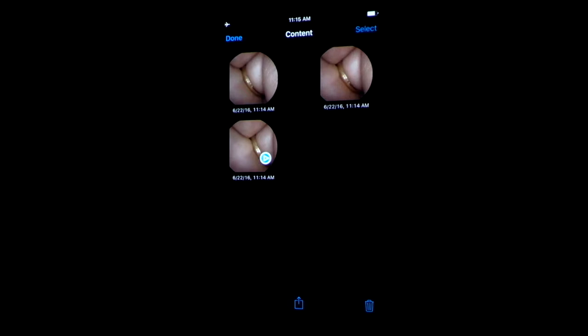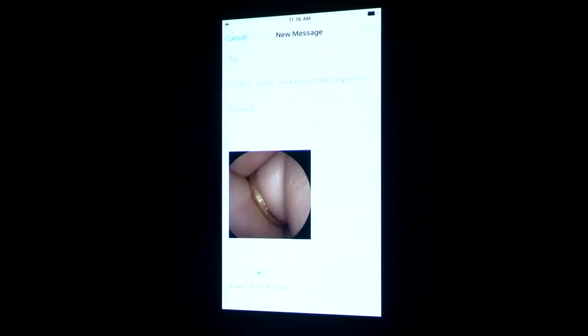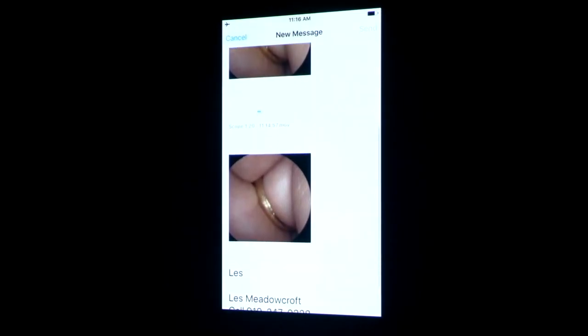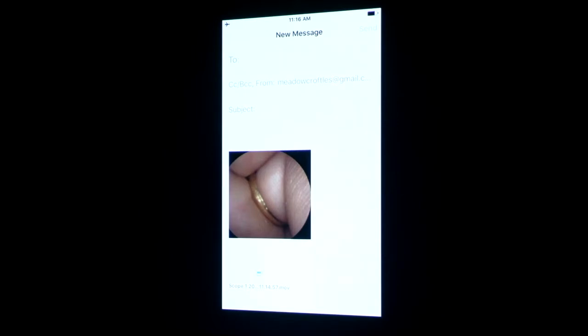To select those images, tap 'Select' at the upper right-hand corner of the screen and then highlight the images you want to email. Once you've highlighted them, depress the blue box at the bottom of the screen with the up arrow, and it will bring up a variety of options to send those. You can AirDrop them to another device, you can email them — that brings up your email system and the videos as well as pictures can be easily emailed off to a client.